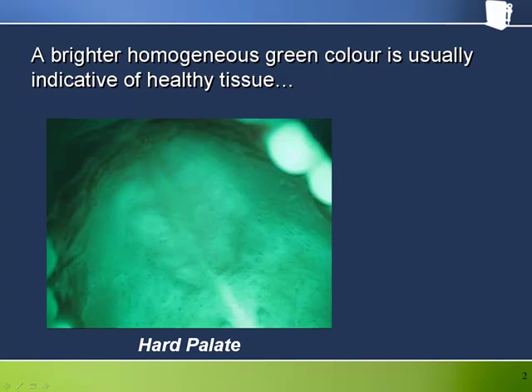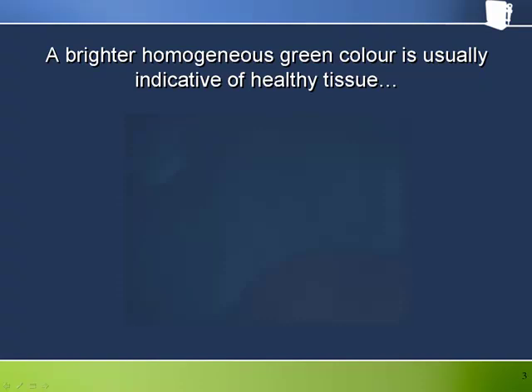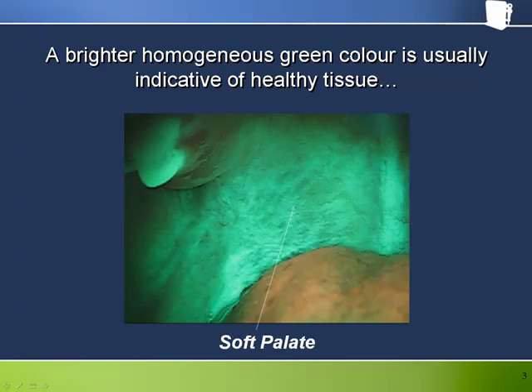Here we see the hard palate which shows, generally speaking, as a broad expanse of green. The soft palate is also generally green. The darker areas around the borders of this image are from shadowing due to the way the blue light has been directed at the tissue.